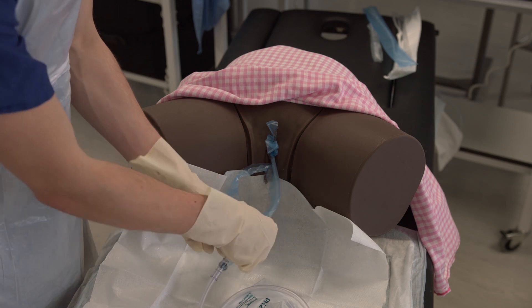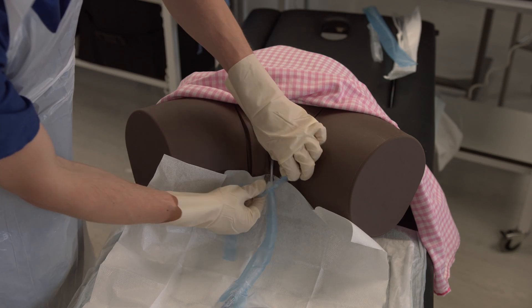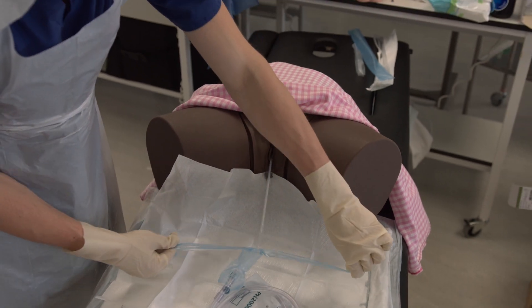Once the balloon is inflated, pull back on the catheter until there is slight resistance to seat it at the base of the bladder. Then remove the remaining perforated packaging.